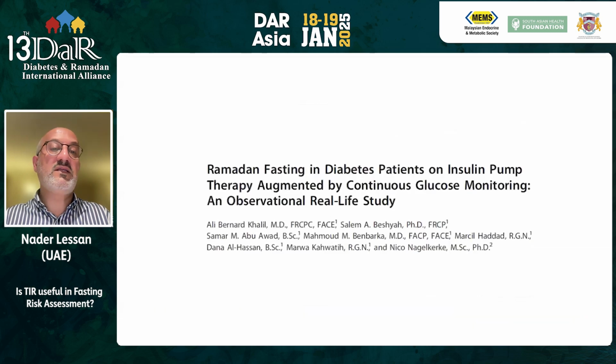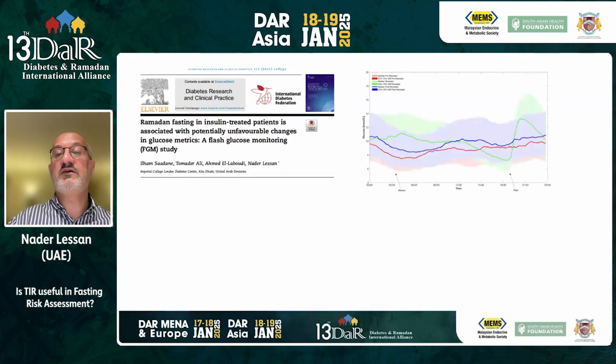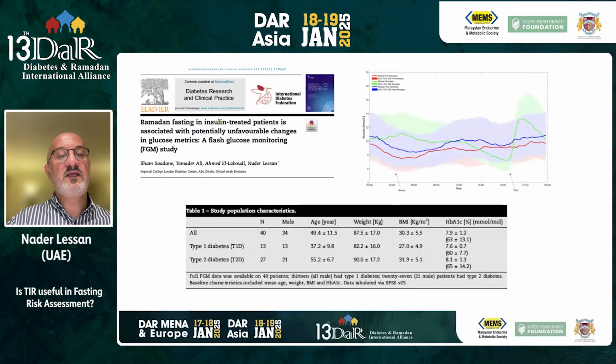And there are studies, including studies on Ramadan fasting from Dr. Ali Bernard, Dr. Salim Bishaya, who's probably almost certainly in the audience. And our group have done a number of studies, and this is one of them. From our data, we thought that Ramadan fasting in insulin-treated patients is associated with potentially unfavorable changes in glucose metrics. Those are the curves that we generated, fasting and non-fasting for Ramadan and non-Ramadan.